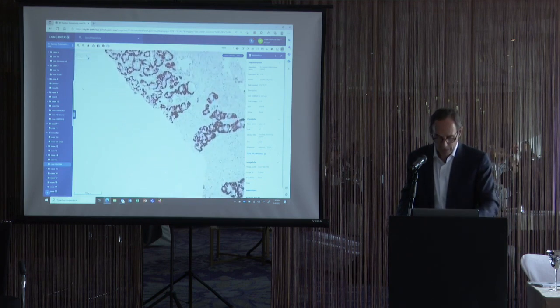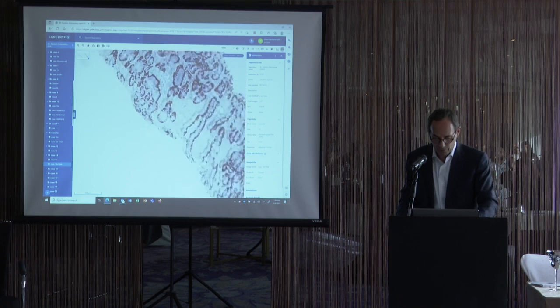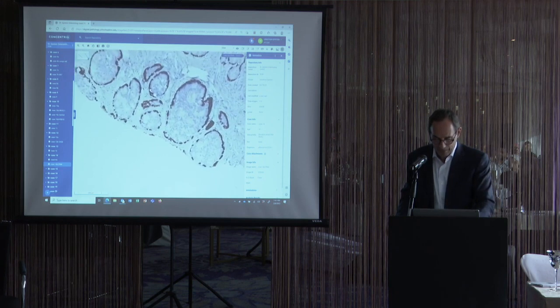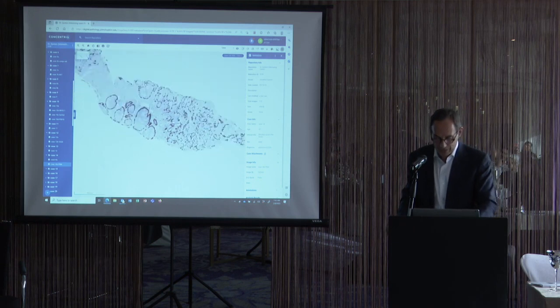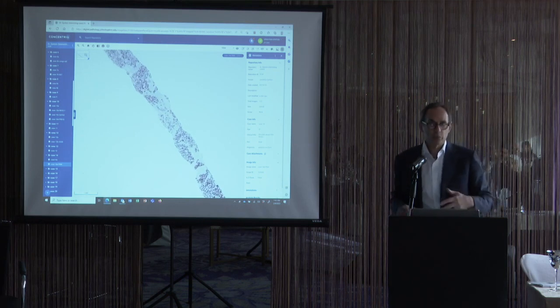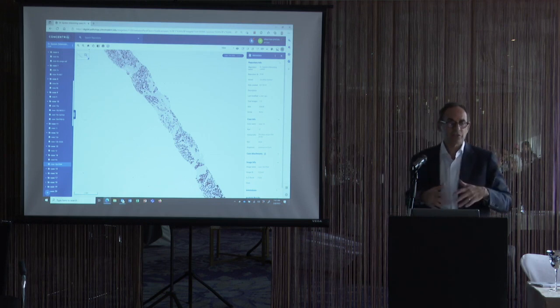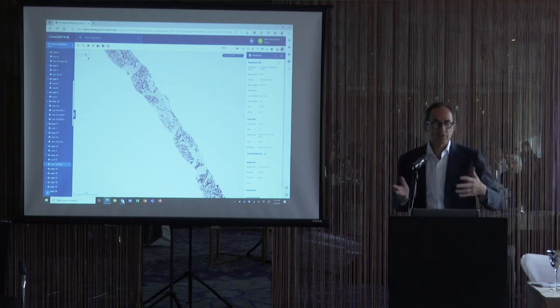And there may be one or two glands in here that are patchy, but are negative, but that's fine for adenosis. If you go down to the cribriform glands at the bottom, they also have basal cell layers. Now you could argue maybe that's intraductal cancer or AIP, but there's no cytologic atypia, so that's inconsistent with AIP. So this is cribriform hyperplasia. So this is a case of just extensive florid adenosis and some cribriform hyperplasia on the needle, where the low power looks like cancer, but then when you go to high power and try to find other features for cancer, they're not there, and you have to ask yourself, could this be a florid benign mimicker?